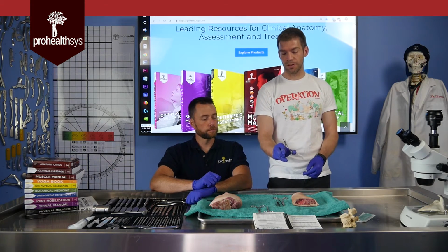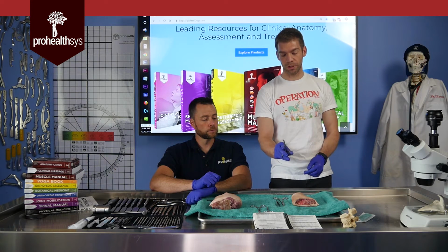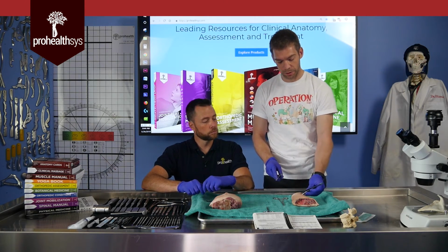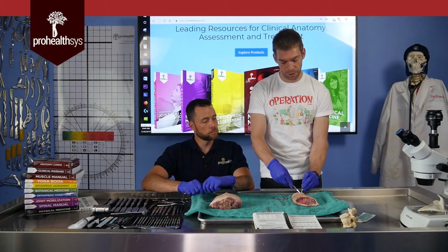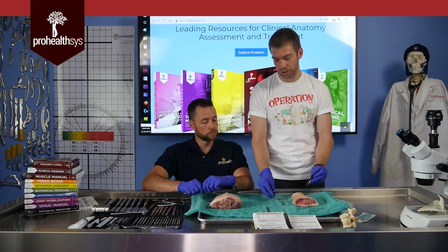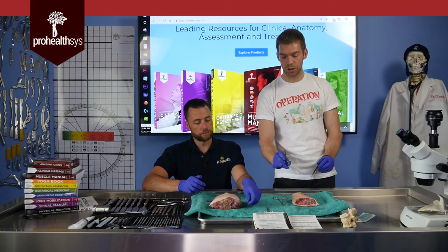These are, you guessed it, scissors. They're used mostly for cutting suture material. If this was a laceration where we were going to sew together or suture together the deep fascia, we'd use them to isolate it either in a reverse dissection technique or a forward dissection technique, but we're not going to do that today. This is mostly just for cutting suture material.